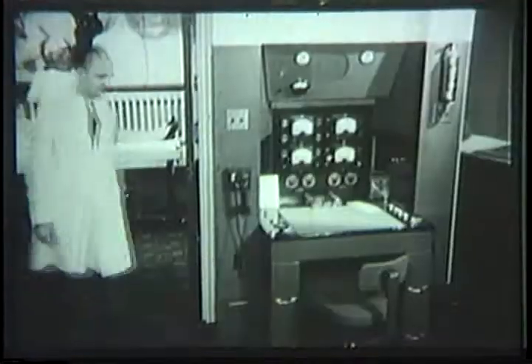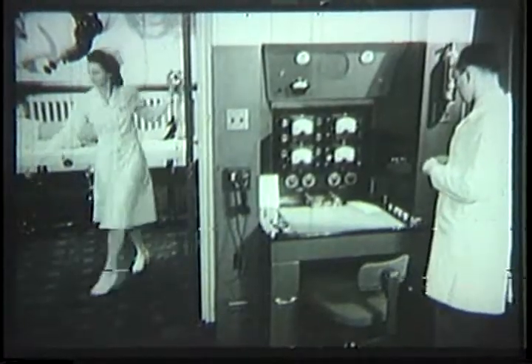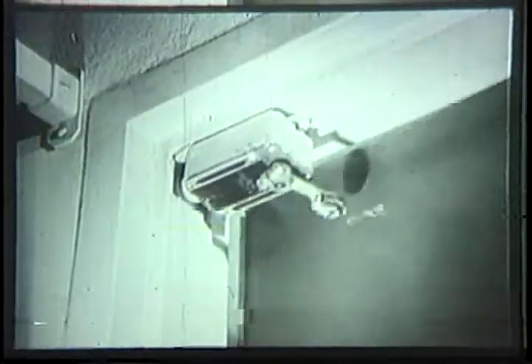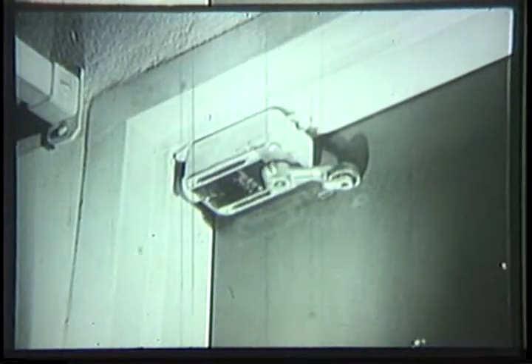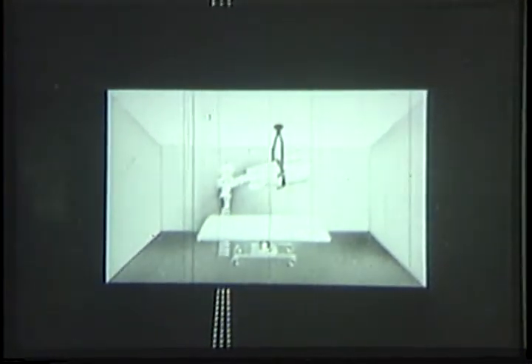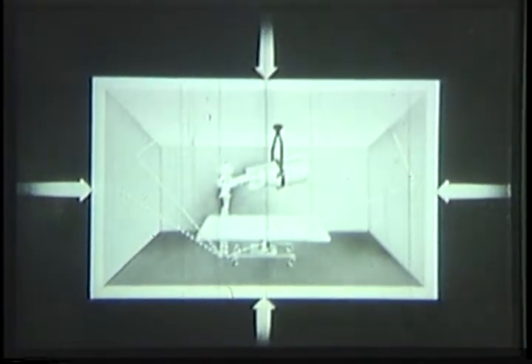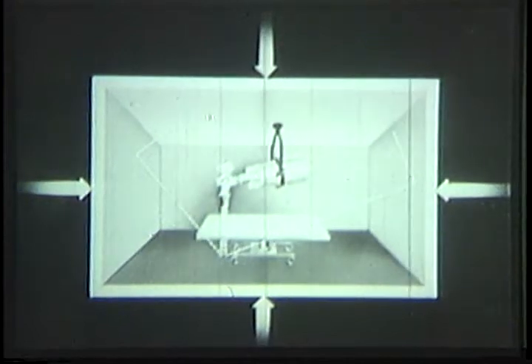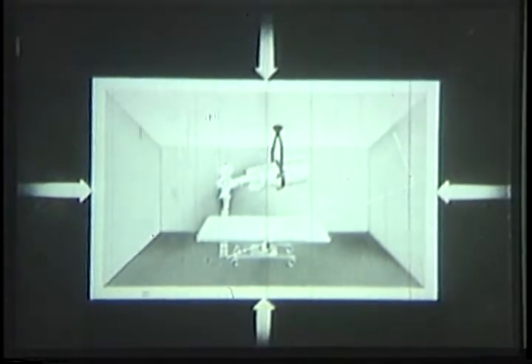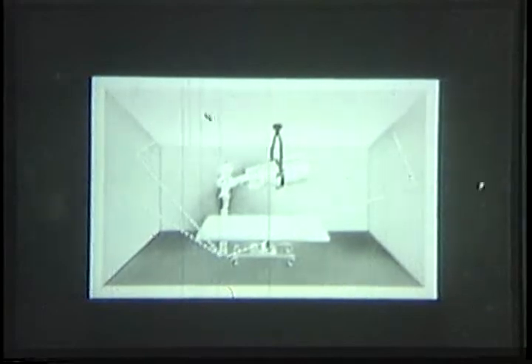Before the technician leaves, she makes a quick visual check of the treatment room. Not until the lead-lined door is shut can the X-ray be turned on, for a safety switch is there to prevent accidental exposure to X-rays. X-rays scatter about a room by a process of reflection and penetrate ordinary walls. But by lining the treatment room with lead, the scattered rays are kept within it. The door and the windows, too, are lead-lined. In this way, X-rays are confined to the area of treatment, which is important because the nurse technician should guard against unnecessary exposure to X-rays.